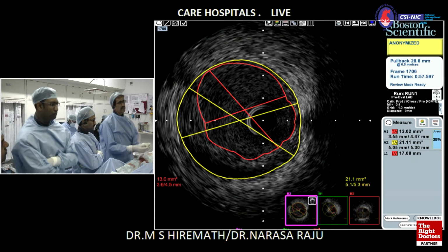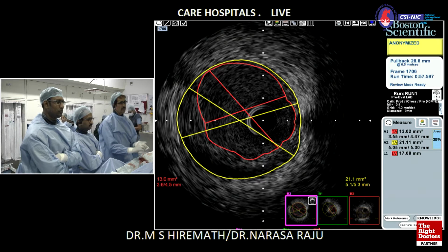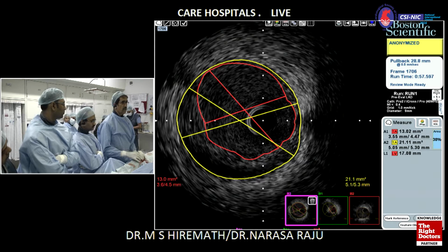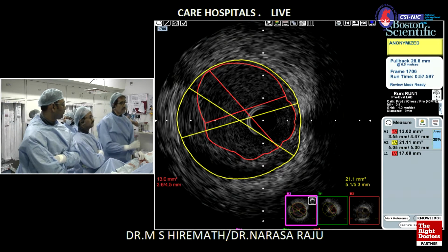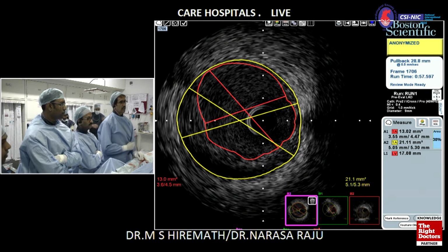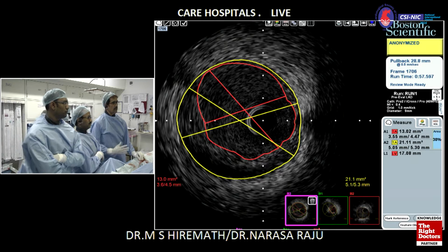No. Here, I think the left main is very long. And I think we have almost half the left main free of disease. So I wouldn't worry to come back to the ostium, especially since the IVUS is showing that from mid-shaft backward to the ostium, the left main has no disease at all. I agree, yeah. So we would be stenting, just show us run number 2 again here. We would be stenting just where the lesion is, say mid-shaft to covering the lesion into the LAD.